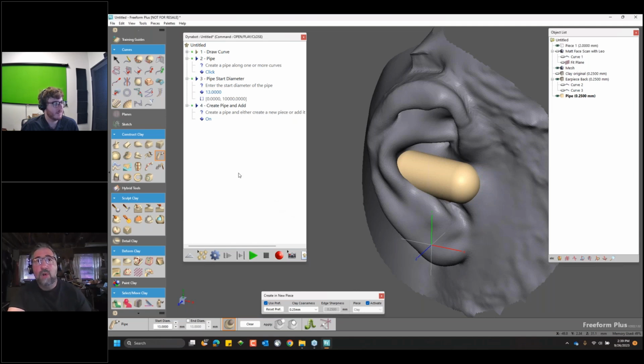Looking at the time, we're getting close to the end of this. I think we might want to move on to the wrap up so we have plenty of time for Q&A, but Freeform as a design tool does give you the power of working with a digital representation.